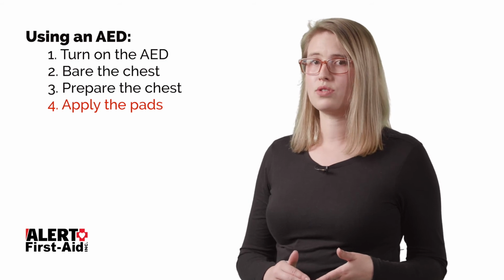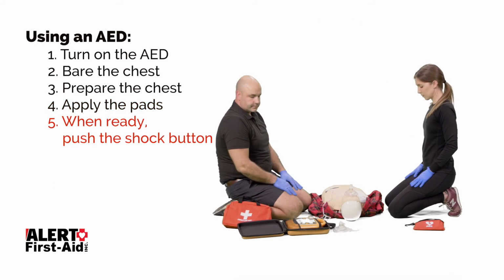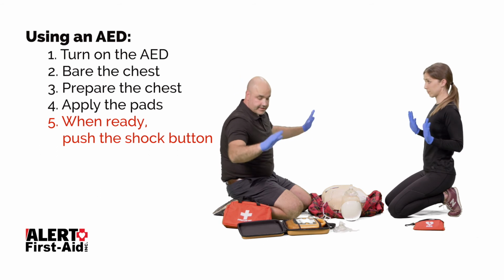Once both pads make good contact with a person, the AED will know. It'll tell you that it's analyzing and to not touch the patient. Make sure everyone is standing clear when it asks. If it determines a shockable rhythm, it'll tell you to push the shock button. Make sure no one is touching the patient.